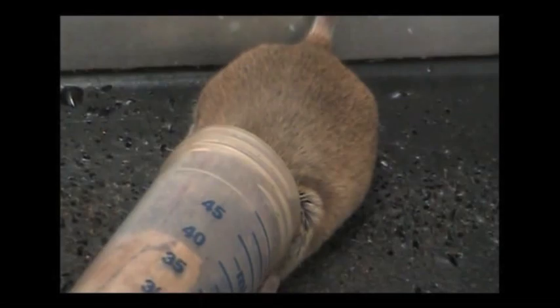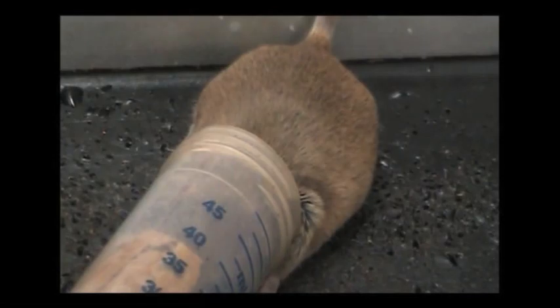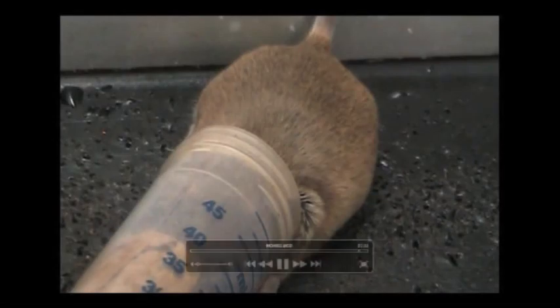When you know that he's completely knocked out, his breathing will start to slow down until the point where he'll start to have large gasps. Then he'll have a final gasp, and that will be the point in time in which he is completely anesthetized and it is fine to continue on with the procedure.